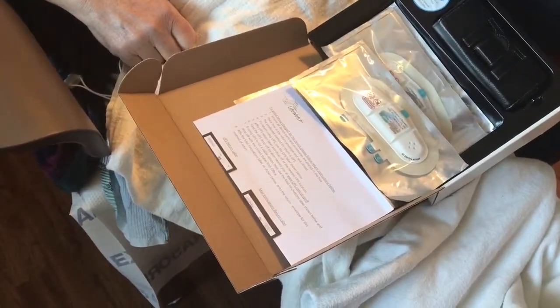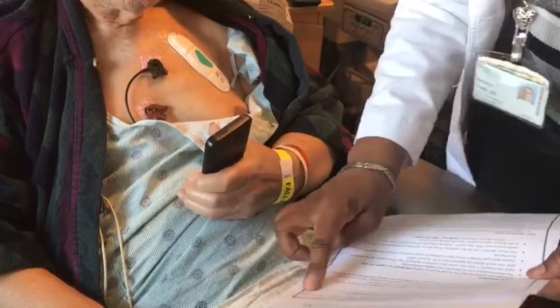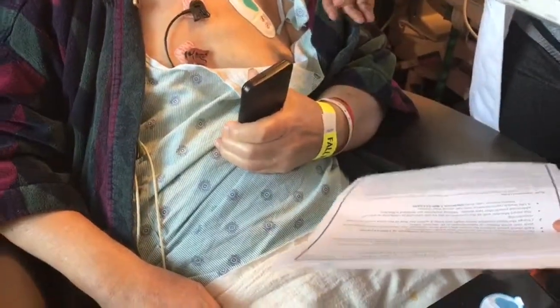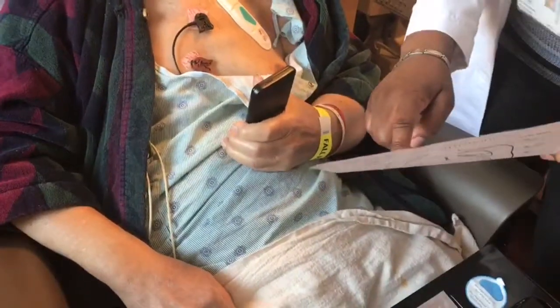The enrollment we received is for the patient to wear it for 14 days, so we're going to return it on the 27th. Instructions are here — I already set it up for you. LifeWatch might call you if they're not seeing good connectivity. It's an 800 number, so just remember to pick it up.